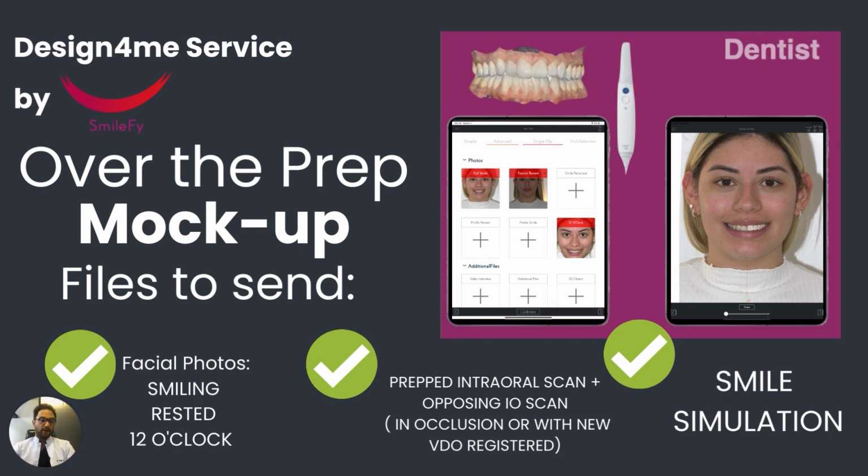After you send the files for your Design4me service, you will receive these files back into your SmileFy account in 24 hours or 1 business day. And you'll be able to receive a couple of short videos teaching you how you can make small modifications or how you can export these print-ready files for you to test or to perform the restorations that you are looking for in your patient's case.